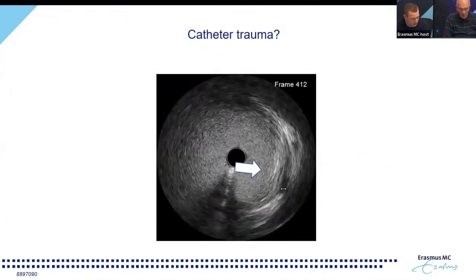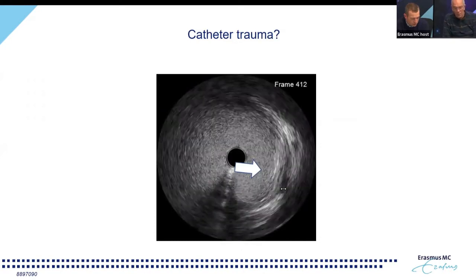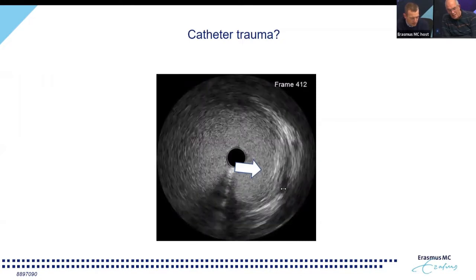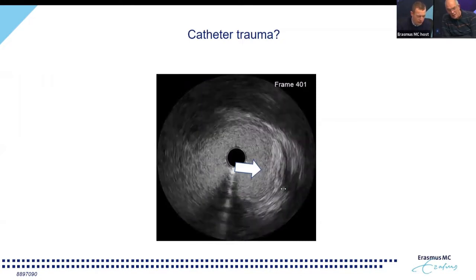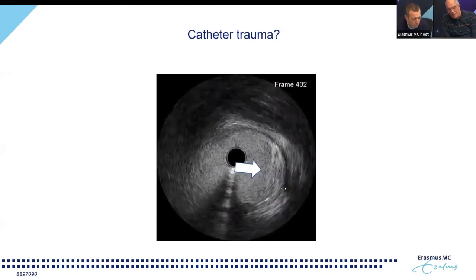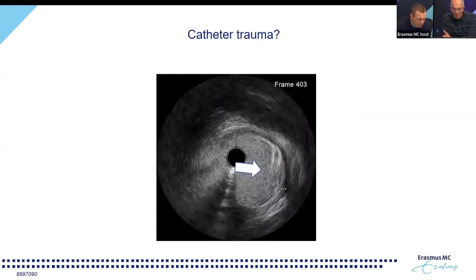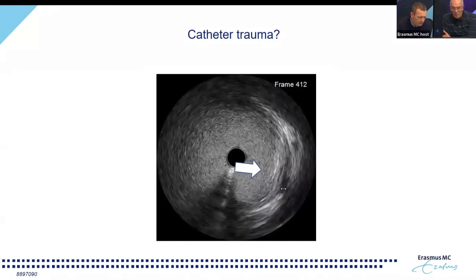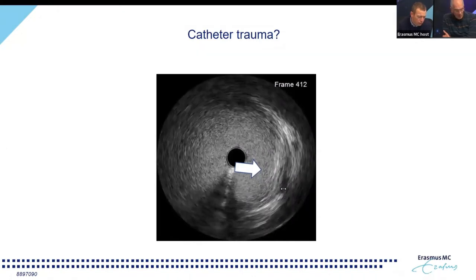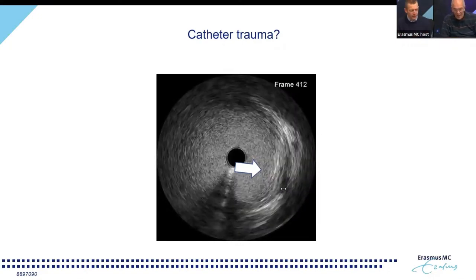But then, interestingly, Jurgen, we also saw here really at the ostium of the LAD, and you can see the IVUS catheter jumping from the ostial LAD into the aorta. You can see here ostial LAD, poof, aorta here on the left. You can see that this lumen gets enormous because of the entrance of the ostium of the left main. And here we can see this hazy, whitish appearing mass from, let's say, 2 to 4 o'clock, which looks a little bit like an erosion in an area where there's no plaque.